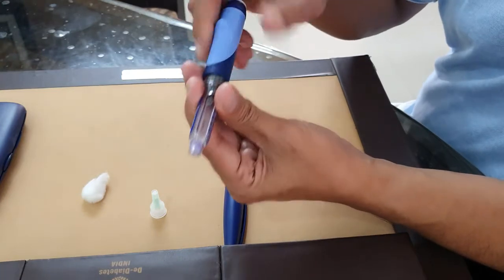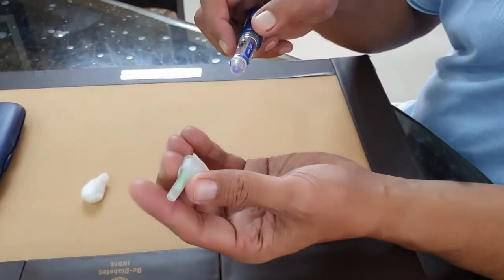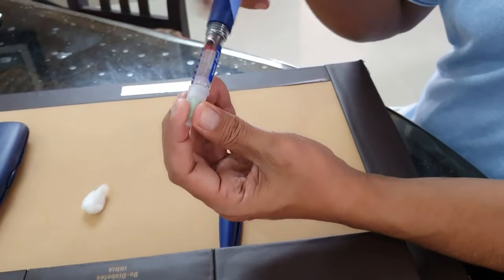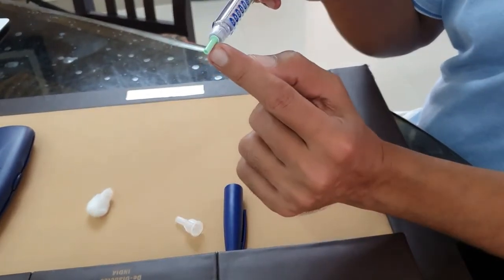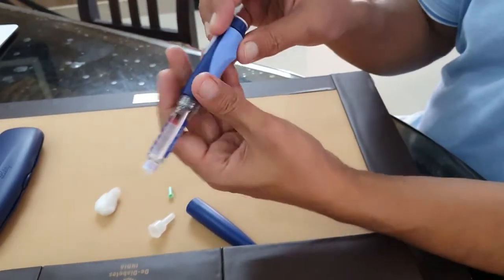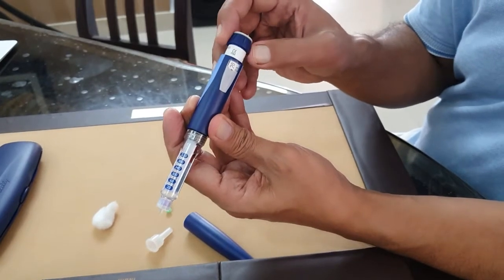After that you take the pen needle and put it like that. Once you put it, remove the cap. Inside that you can see one more small needle cap - remove that.